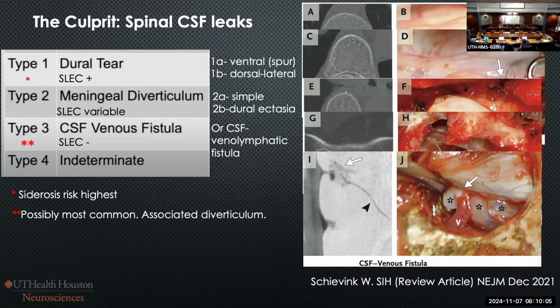Can you talk with Rick? Is contrast put in the CSF and it fills the nerve sleeve? Yes. So is this a serial scan like an arteriogram? You're seeing the flow. Is that how you have to do it? The main secret is it must be decubitus. The myelogram. Okay. But the dye settles in the CSF over there in the nerve root. Correct. And then you watch the dye slowly flow. So you have to do serial imaging like an arteriogram.